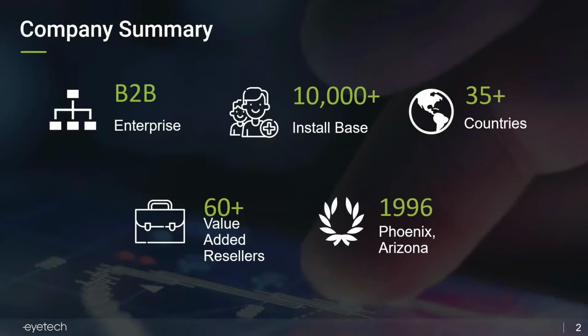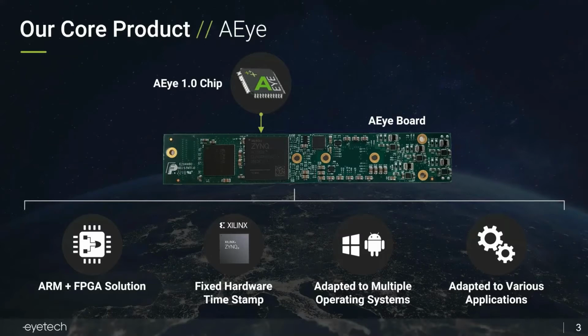BIOPAC and others. We are focused on our core product, which is our eye tracking on a chip technology that we launched several years ago. It leverages the Xilinx Zynq FPGA. It's a great platform that gives fixed hardware timestamp data, so you get very reliable results every time, regardless of whatever computer you're using. You get the same data quality because it's all done on the chip.